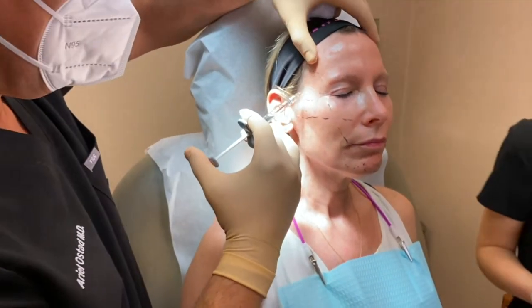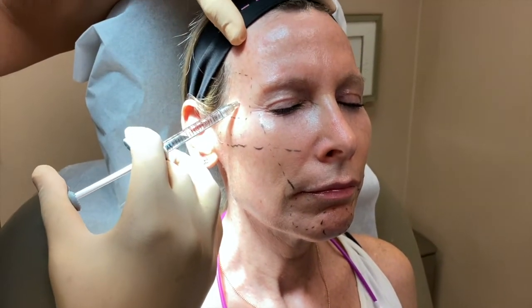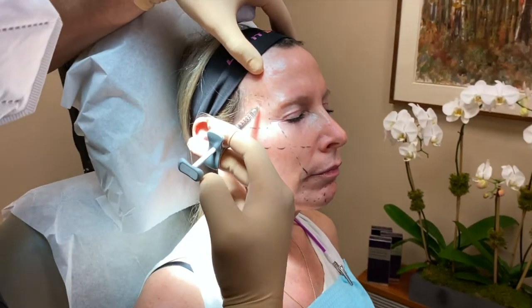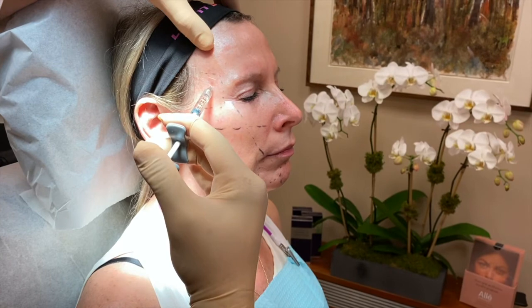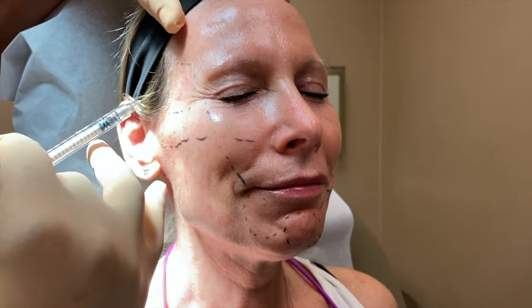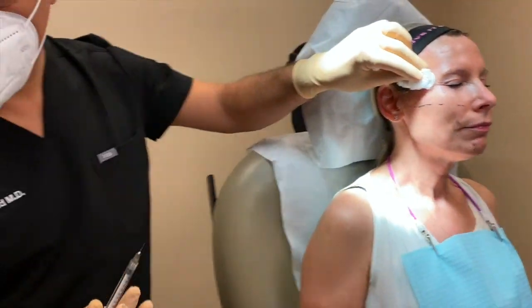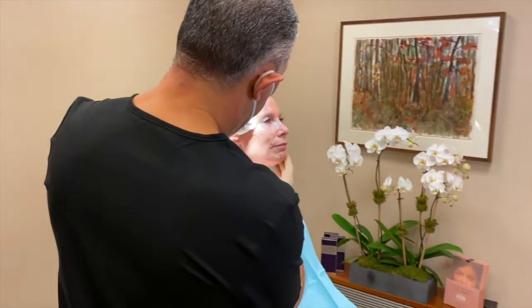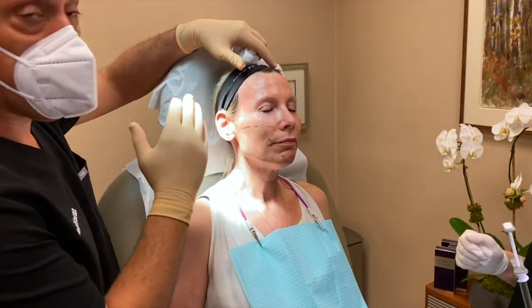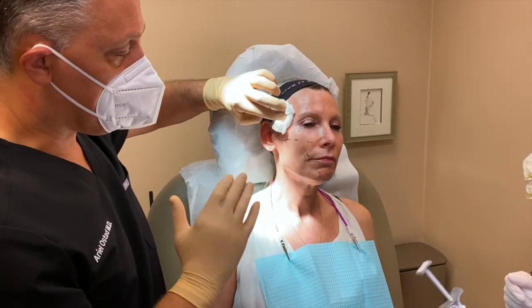So you're going to feel a little pinch. I'm always aspirating as I inject. How are you doing? Good. Great patient, Adrian. Okay, all right, so that was one syringe that I used on her temple. And you can see how the hollowness is significantly better. From my experience, she can use a little bit more, but for the purpose of just finishing everything, we're going to hold back here. We're always holding a little bit of pressure.